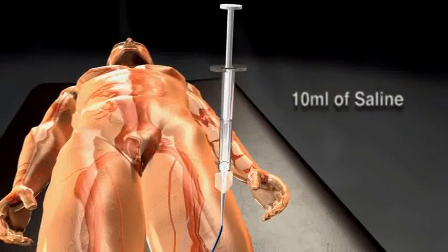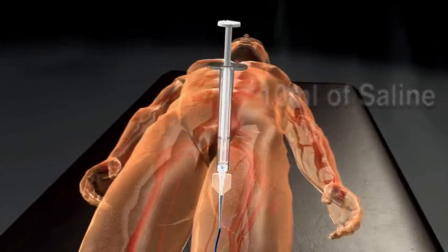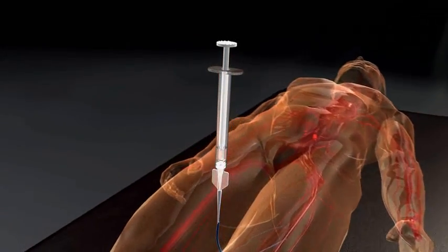Flush the contrast from the microcatheter with 10 mL of saline to expel the contrast media. Leave the syringe connected to the catheter.